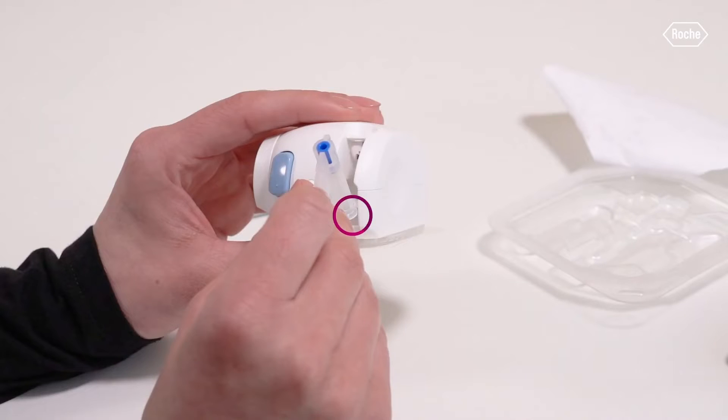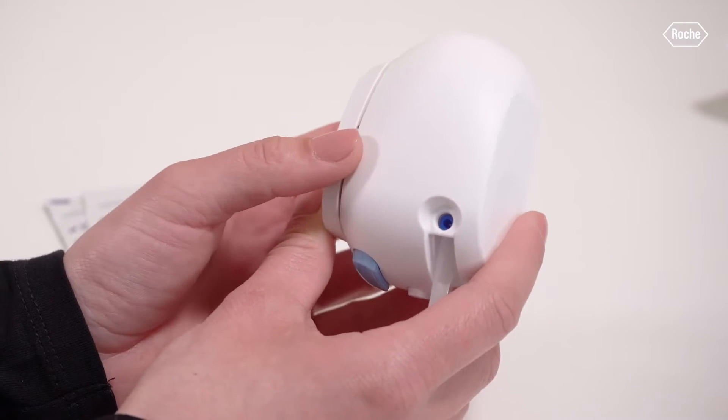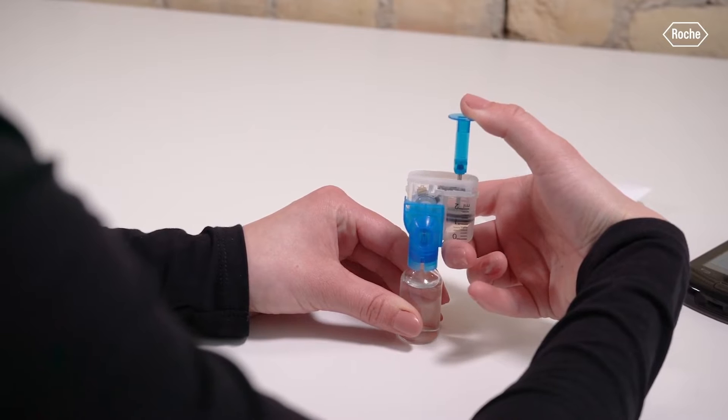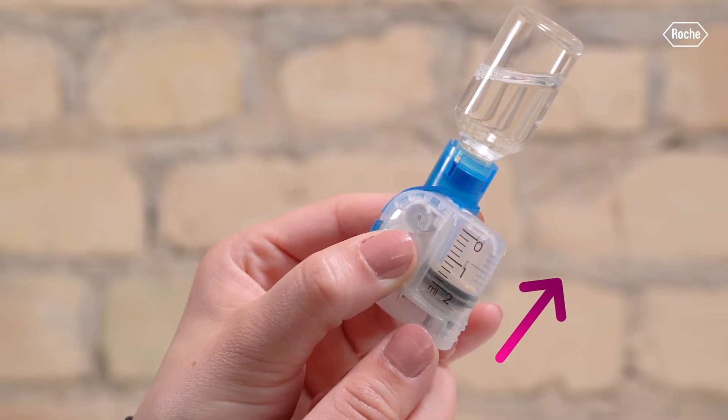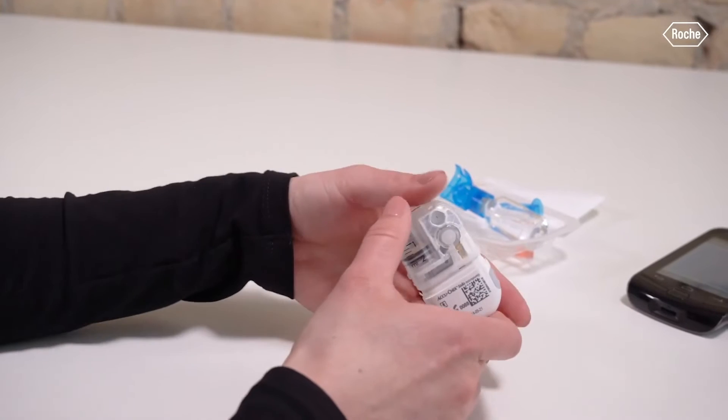Along with the pump pad placed down using the applicator, there's also a cannula piece inserted into the insertion device. The cannula comes in two sizes — either six millimeter or nine millimeter — and is inserted at a 90-degree angle. The cannula is a disposable piece thrown away with the pad every three days. The reservoir is also disposable, connects to the pump base, holds your insulin, and allows it to flow through the cannula. It lasts four days, so if you switch out the pump after three days with insulin remaining, you have an extra day before it goes to waste. The reservoir holds up to 200 units and as little as 80 units, the same as Omnipod.